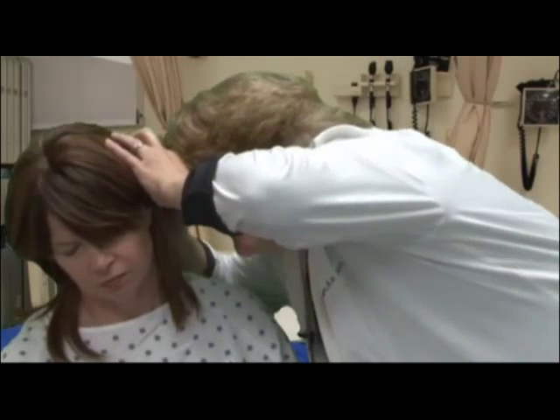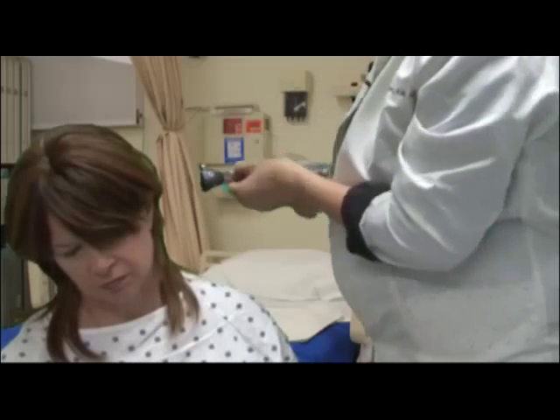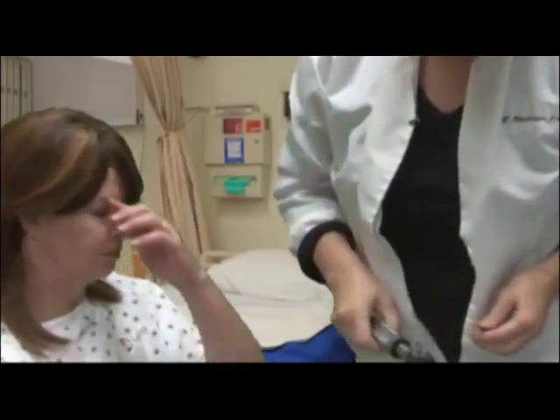I'm going to look. Again, I see a tympanic membrane. This is the left ear, so the cone of light is at the 7 o'clock spot. All right, well, I'm done with the ear exam.